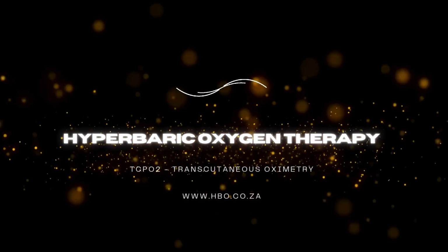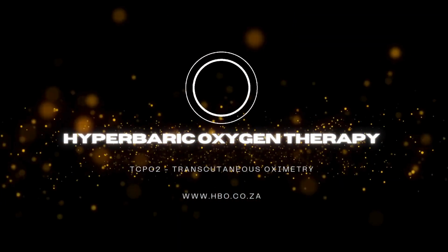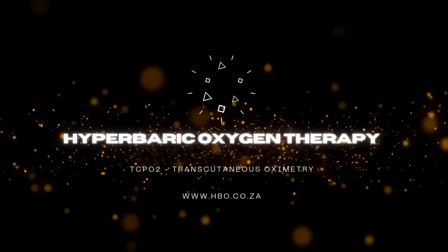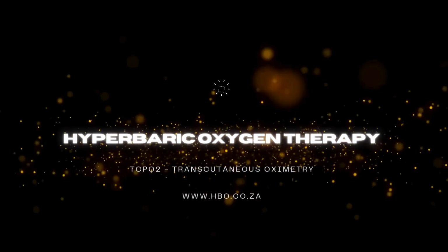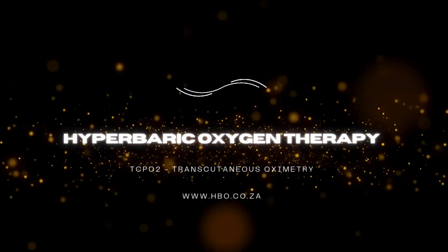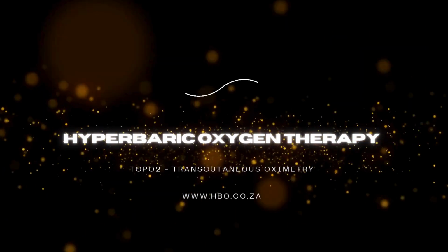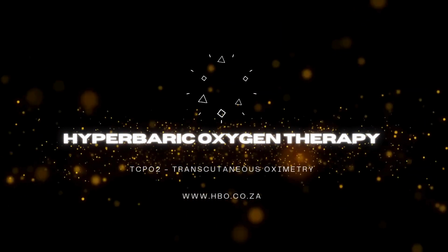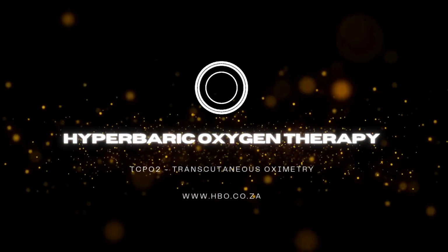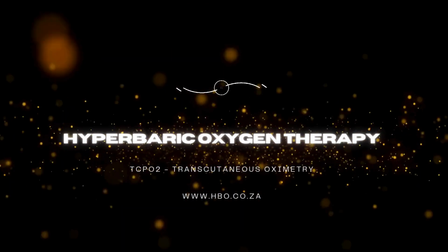Okay, great. Let's get straight to it then. Now, most listeners using HBOT will know TcPO2, but maybe a quick recap. What exactly is it, and how does it fit into the whole HBOT picture? Sure. So TcPO2, it's non-invasive. That's key. It measures oxygen tension right there in the skin's capillary. Think of it as an indirect window into peripheral oxygen delivery and tissue perfusion. It usually uses a modified Clark electrode, with a little heating element built in.